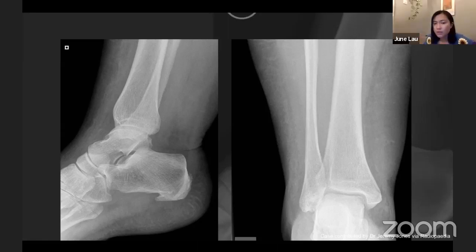I will say this one is very subtle, and think about your special review areas, the extra bones you can see in an ankle.